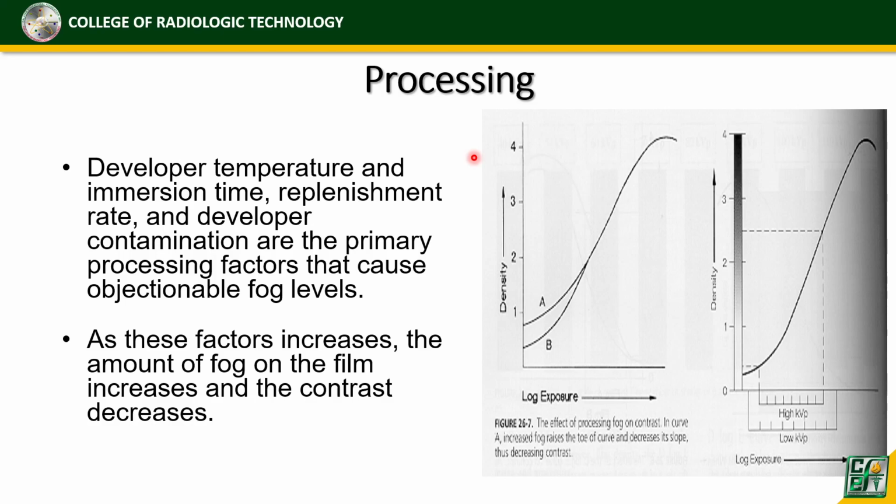Okay. So, as these factors increase, the amount of fog on the film increases and the contrast decreases. So, if you increase the temperature or if the temperature of the developer is too hot, what will happen?